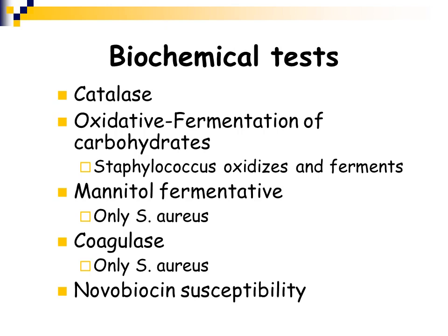All Staphylococcus organisms are Catalase positive. That's a key feature because that is the feature that differentiates the Staphylococcus from the Streptococcus that we're going to talk about next. You can do oxidative fermentative tests, which is oxidation and fermentation of carbohydrates. It's a test using OF media. And Staphylococcus is an oxidizer and a fermenter. So in OF media, it is going to turn the media from green to yellow.